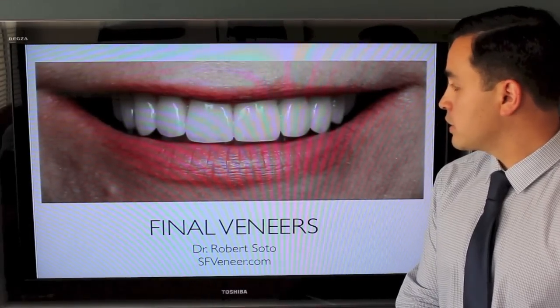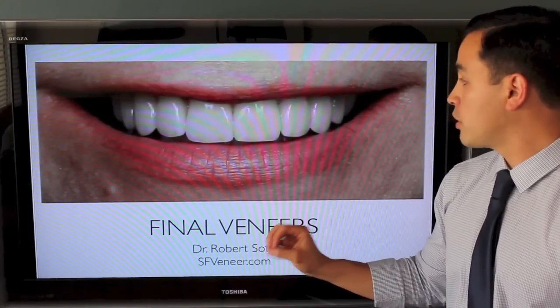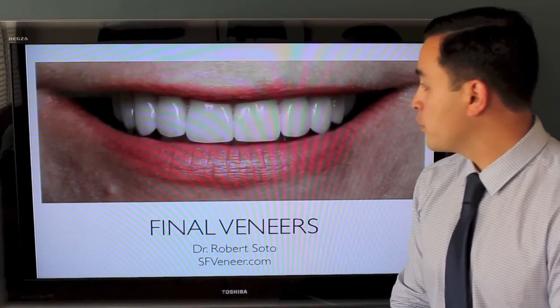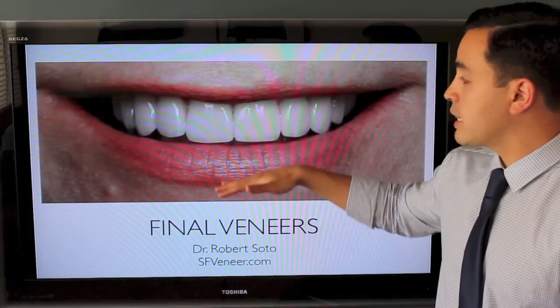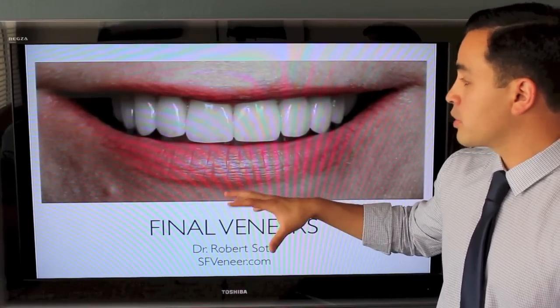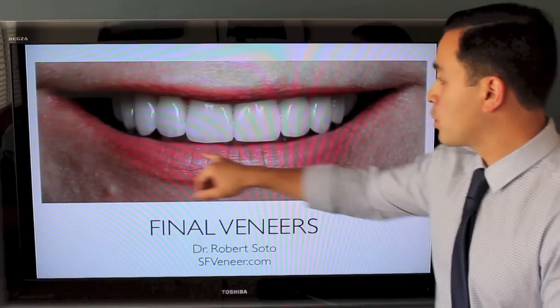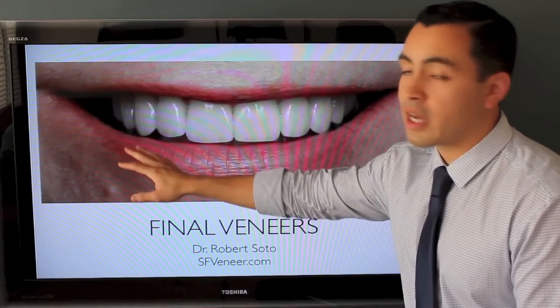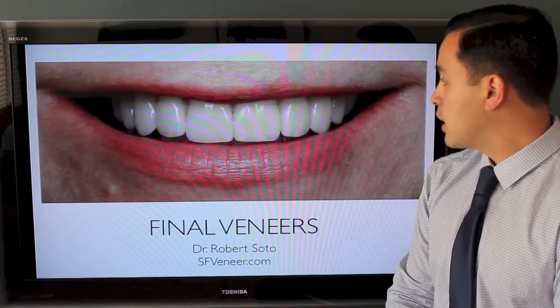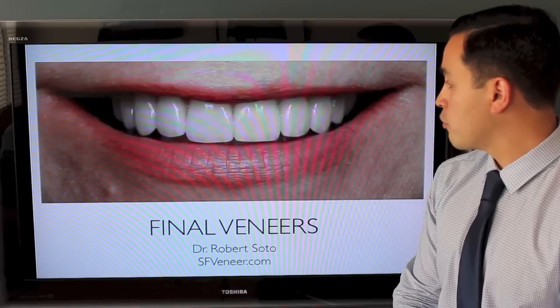These are the final veneers — all porcelain, made out of a very durable, very strong porcelain, and they look fantastic. We achieved our goals: we lengthened the teeth, we have different lengths to the teeth and the proper shapes, so things aren't flat and it doesn't look like she's ground down her teeth. The canines are more pointed like a canine typically is, and the teeth are parallel, which is the look we were going for.